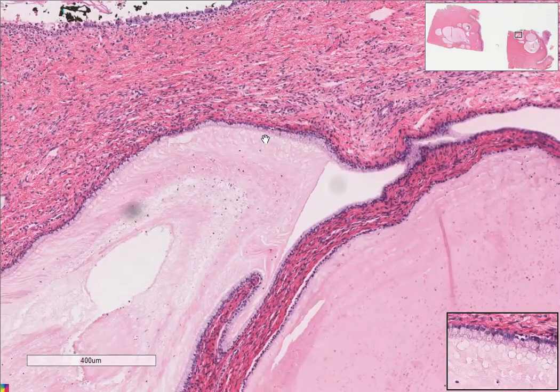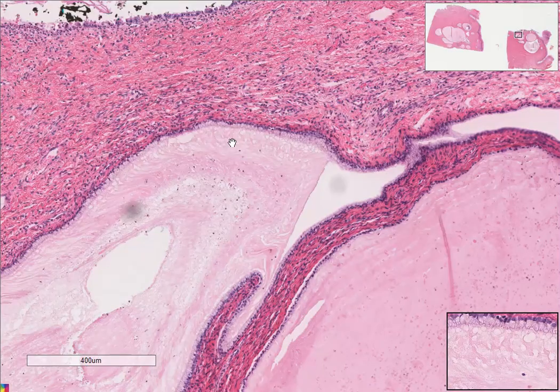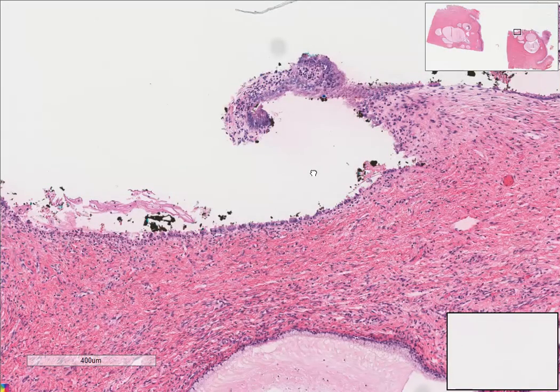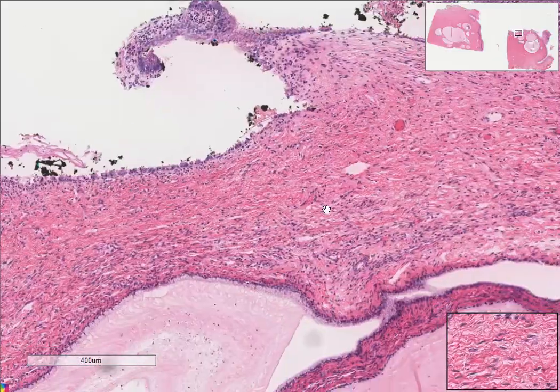Also, the endocervical glands are lined by simple columnar epithelium, which also secrete mucin, which helps lubricate the endocervix, which is what I was trying to get at with these cells here.